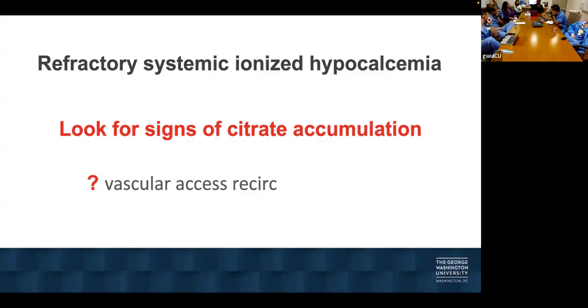So where do we put the IV calcium? Because this is calcium chloride, right? Calcium gluconate. You can do that peripherally. So this person's gonna need a midline, likely. You can't just have your dialysis catheter as your only access. If you have a good peripheral line, you can do it. We have everything set up as calcium gluconate already, mixed by the pharmacy, and the order is there. So everything is in one set format.